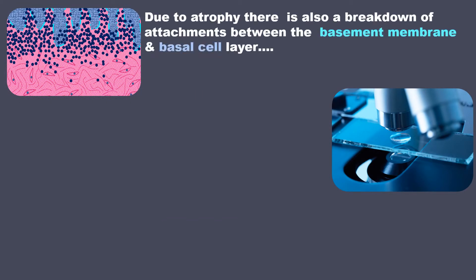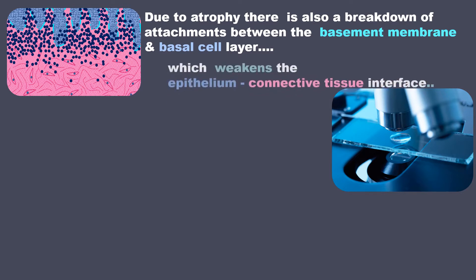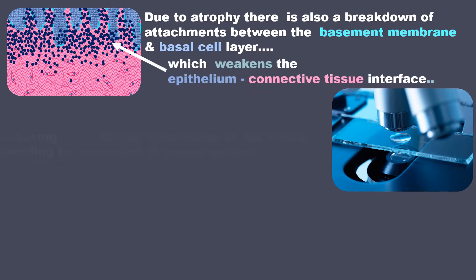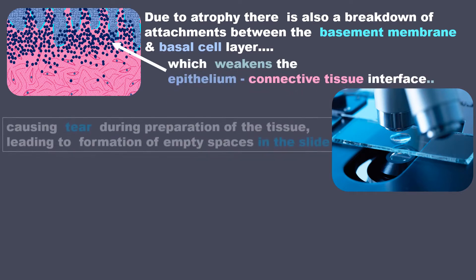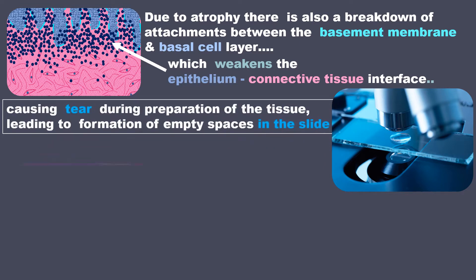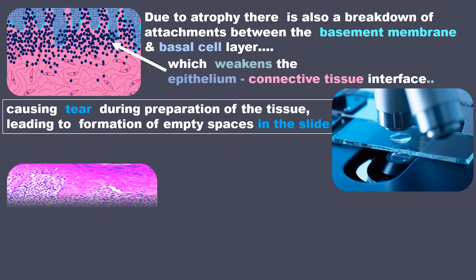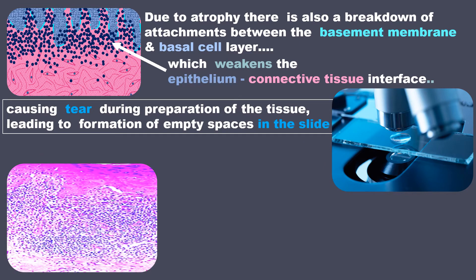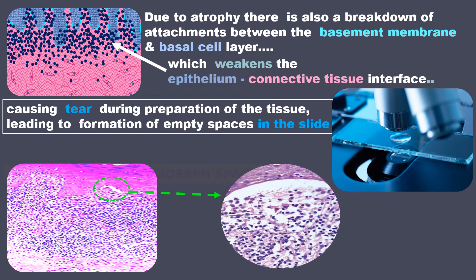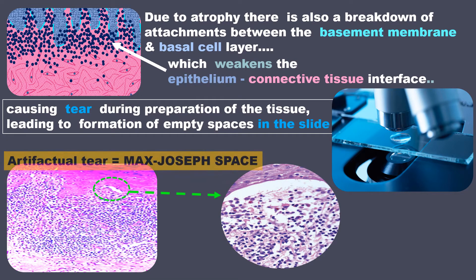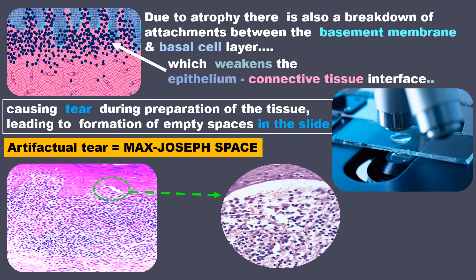Due to atrophy, there is also a breakdown of attachments between the basement membrane and basal cell layer, which weakens the epithelium-connective tissue interface, causing tears during preparation of the tissue and leading to formation of empty spaces in the slide. This is basically an artifactual tear and is called Max-Joseph space.